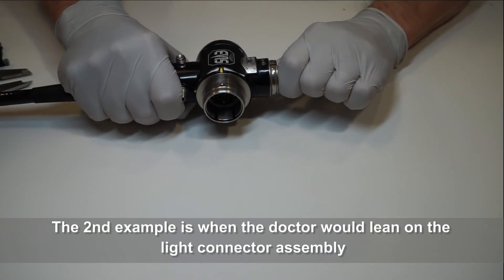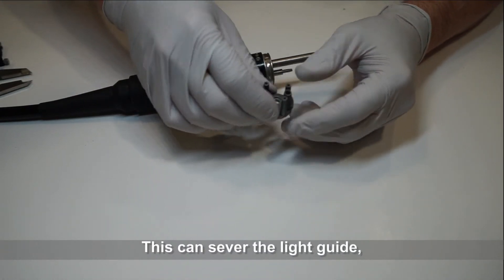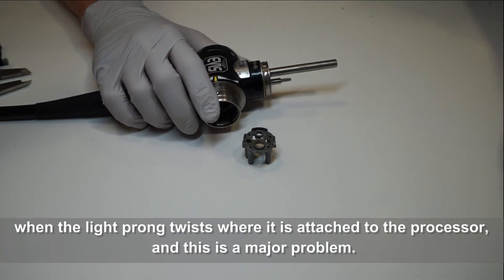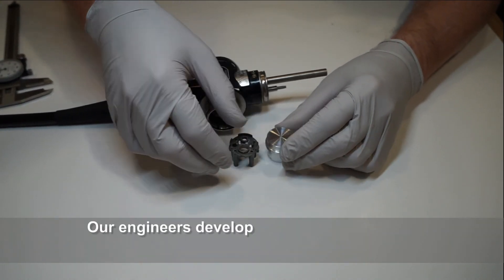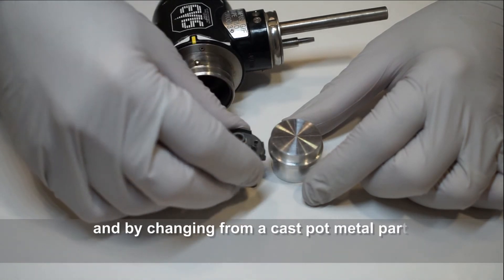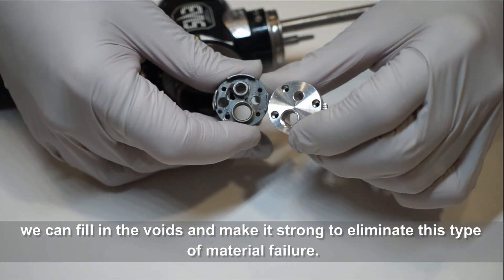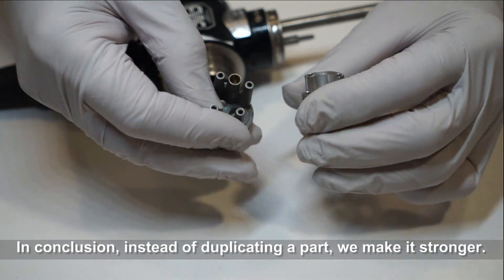The second example is when the doctor would lean on the light guide connector assembly and break the chassis inside. This can sever the light guide, crack the housing, and cause damage to the air connector when the light prong twists where it's attached to the processor. This is a major problem — having a durable part is more than desirable; it's necessary. Our engineers developed a more robust part, less prone to breakage, by changing from a cast pot metal part to a machined 6061 aluminum, filling the voids to make it strong and eliminate this type of material failure. In conclusion, instead of duplicating the part, we'll make it stronger.